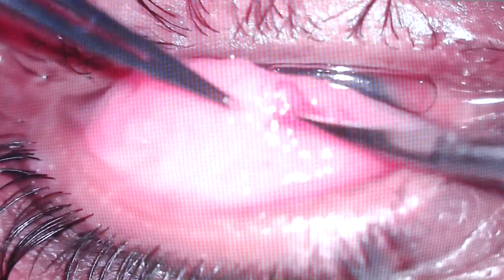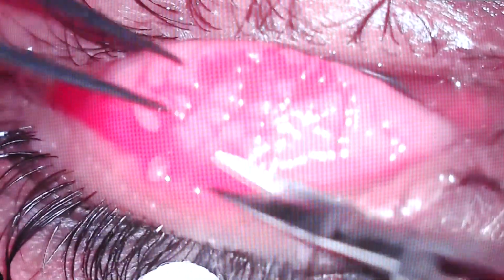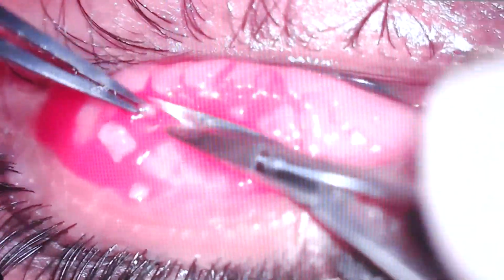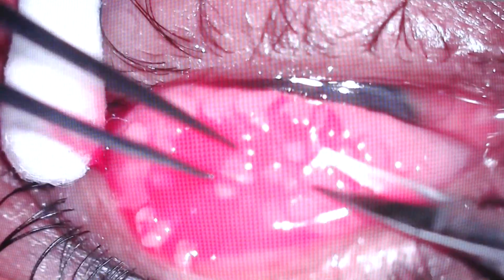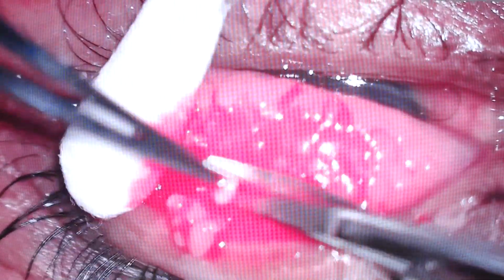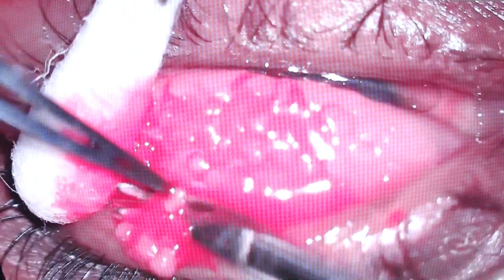The surgery can be cleaner if you have access to a radiofrequency cautery, which many of the oculoplasty surgeons use. You can borrow that instrument from them and use it to cause a much cleaner dissection and less bleeding on the ocular surface. Whichever method or instrument you have access to, you can use it, knock off the offending papillae, and then apply an amniotic membrane over the raw surface which is created.